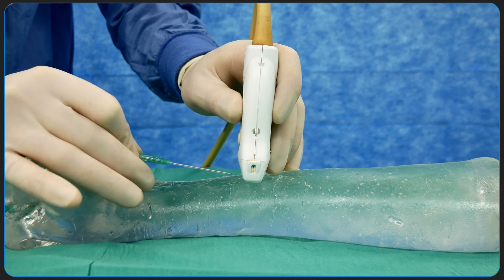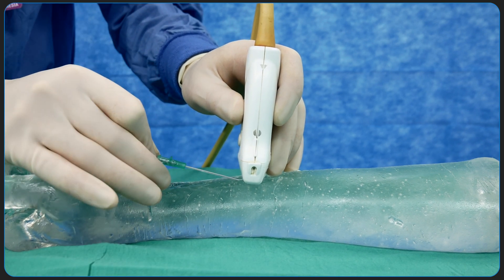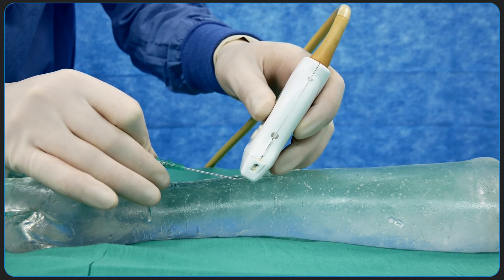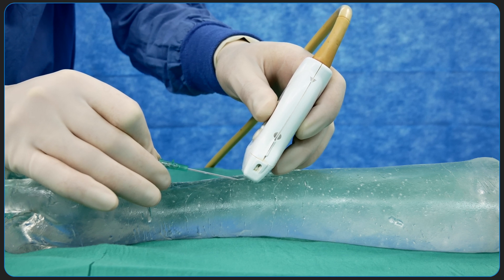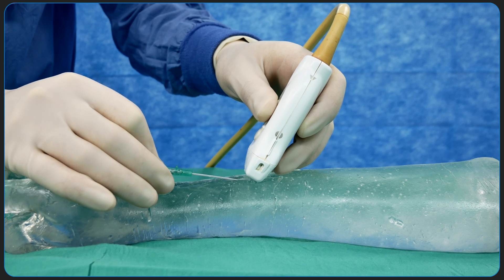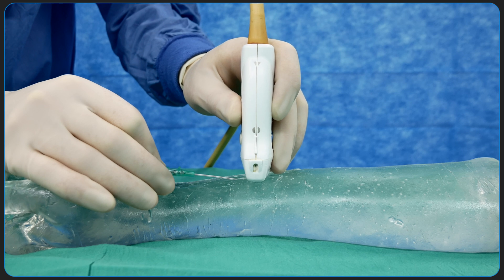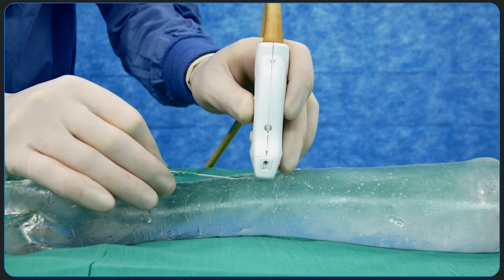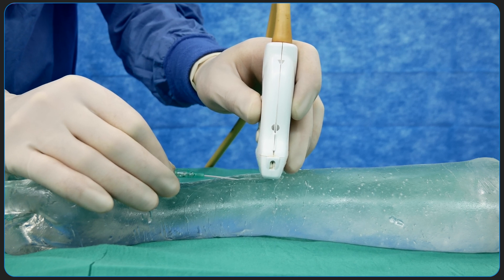In this first stage, from skin insertion to entry into the vessel, the operator tilts the ultrasound transducer to ensure that the beam is approximately perpendicular to the plane of the bevel. As the needle is advanced, the ultrasound transducer is translated with a similar angle to continue to visualize the bevel. After entry into the vessel, tilting of the probe is less important and the angle may be maintained or decreased to optimize visualization. In this specific example, the angle is maintained.